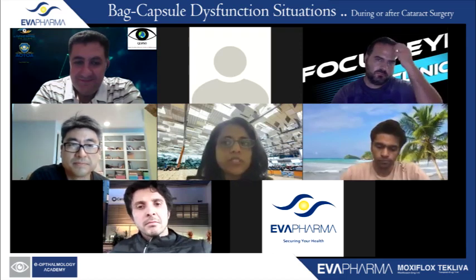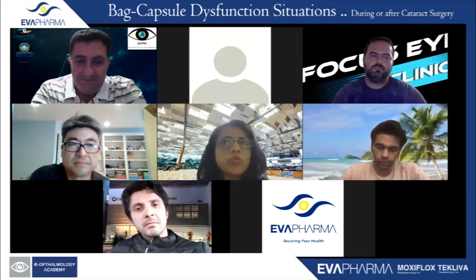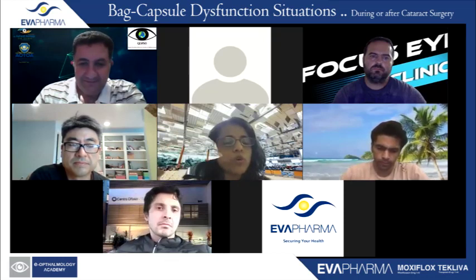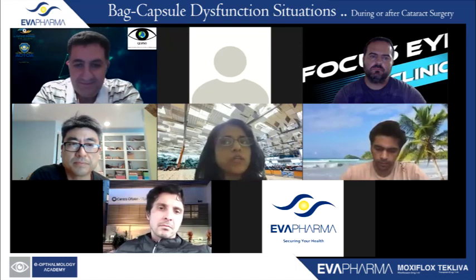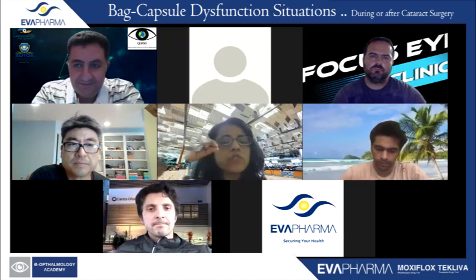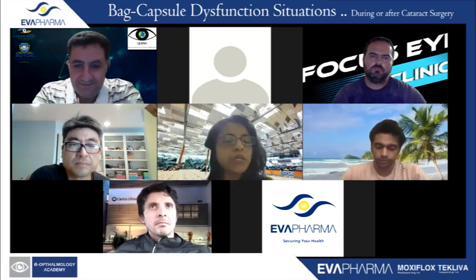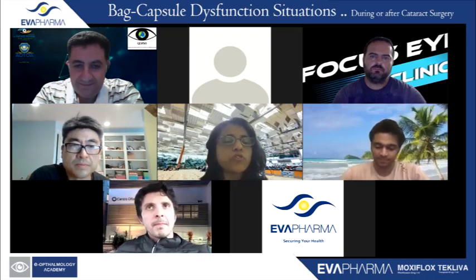I do have a question. How do you know how much you need to do that low temp cautery for? How big a flange, or rather, do you try to just adjust the size of, just get that flange and then stop with that, or do you try to also shorten the haptic at the same time on both sides? If you're not trying to shorten the haptic, you're just trying to get a flange.